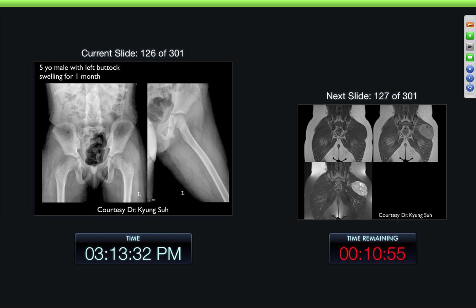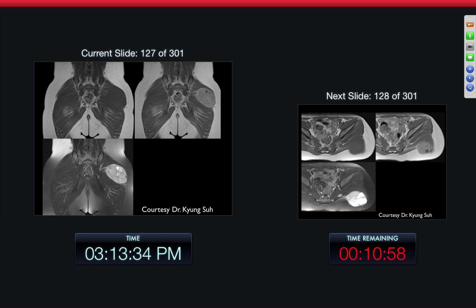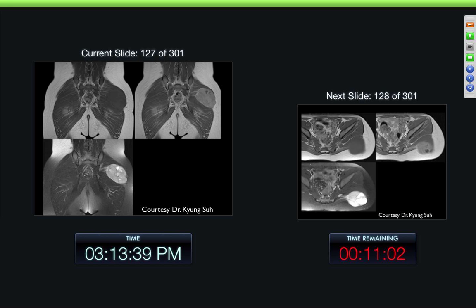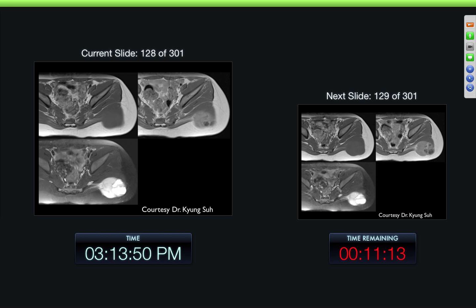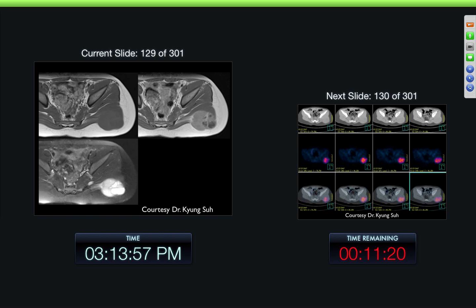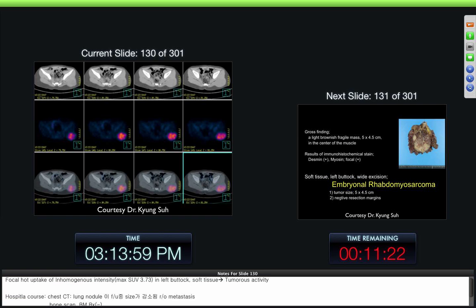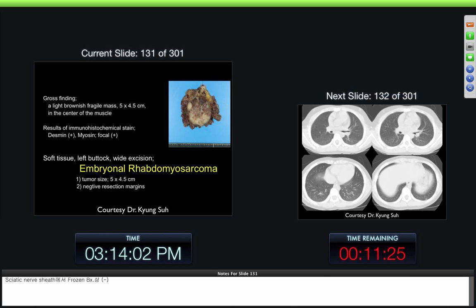Five-year-old male with left buttock swelling for one month. Here we can see a mass — this one's relatively sharply demarcated around the margins. Looks like there's some vascularity going into it, but inhomogeneity within it on the PD-fat-sat images as well as the PD images. Inhomogeneity — looks like areas of either fluid or necrosis within the lesion. A very avid PET uptake. And this was an embryonal rhabdomyosarcoma.